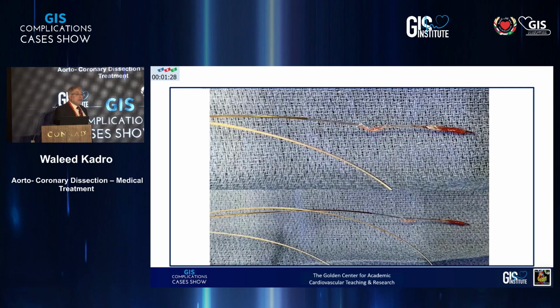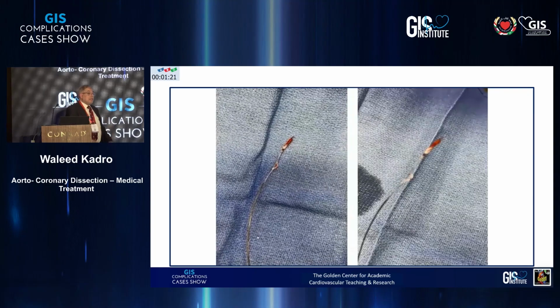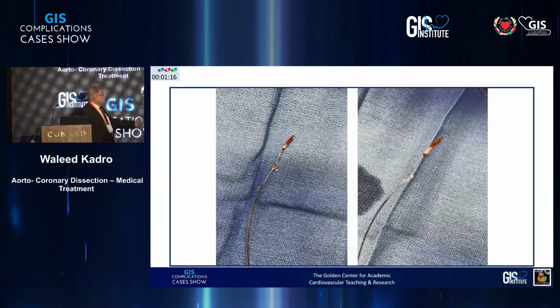So I went to the balloon. I went to the trash and got this balloon. And this is what happened. I tried to inflate the balloon, and what you see here is the leakage, the balloon is inflating with the leakage.